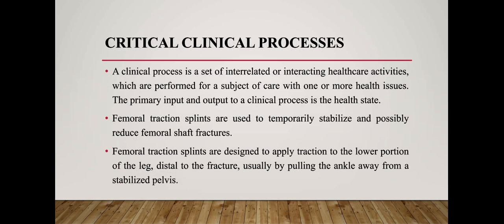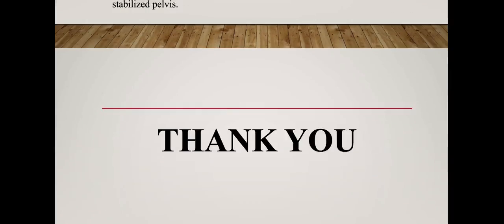Critical clinical processes. A clinical process is a set of interrelated or interacting healthcare activities which are performed for a subject of care with one or more health issues. The primary input and output of the clinical process is the health state. Femoral traction splints are used to temporarily stabilize and possibly reduce femoral shaft fractures.